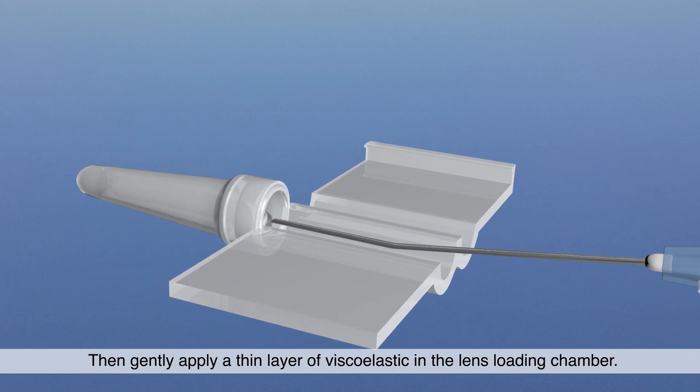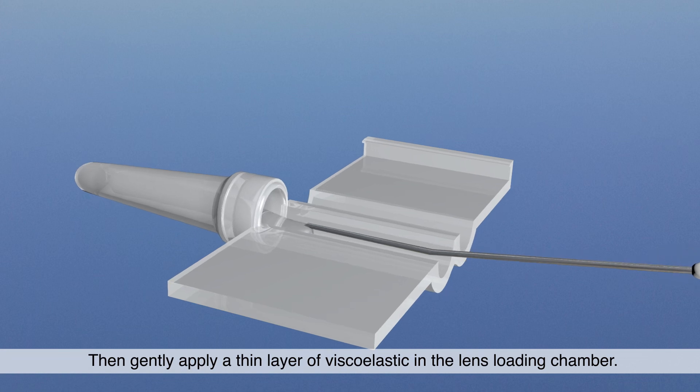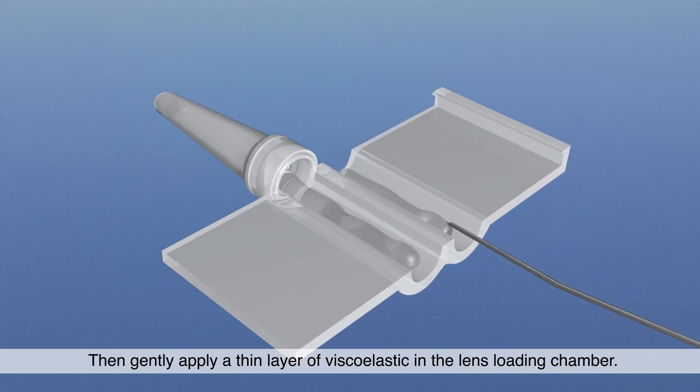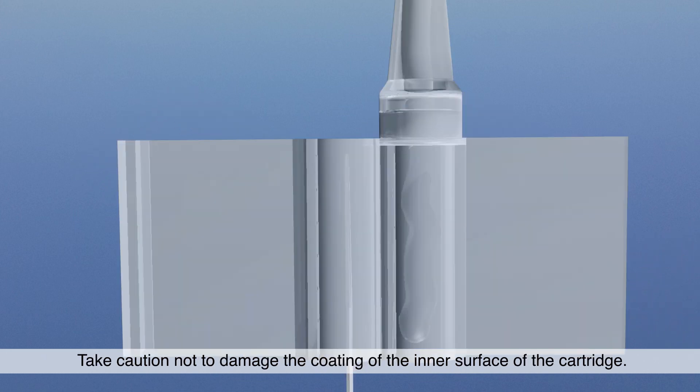Then, gently apply a thin layer of viscoelastic in the lens loading chamber. Take caution not to damage the coating of the inner surface of the cartridge.